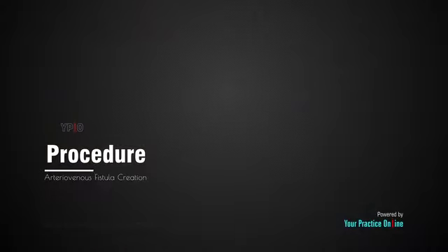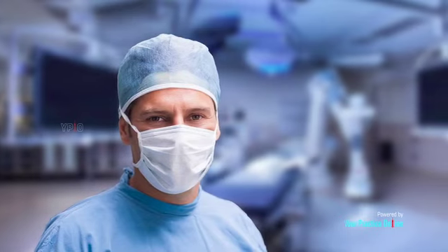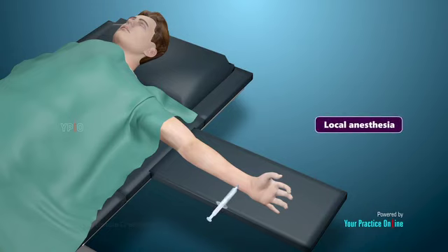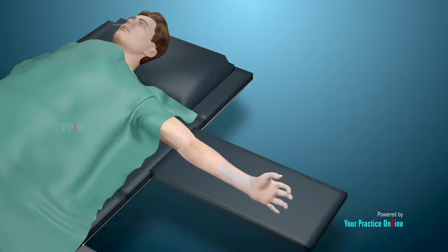Arteriovenous fistula creation procedure. An arteriovenous fistula creation involves the following steps. The skin over the AV fistula site is cleaned with an antiseptic solution, and local anesthesia will be administered to numb the area. Alternatively, general anesthesia may be administered so you are asleep during the procedure. With local anesthesia, you remain awake and may feel some pressure at the site but no pain.